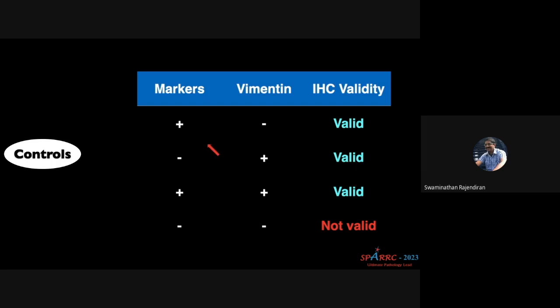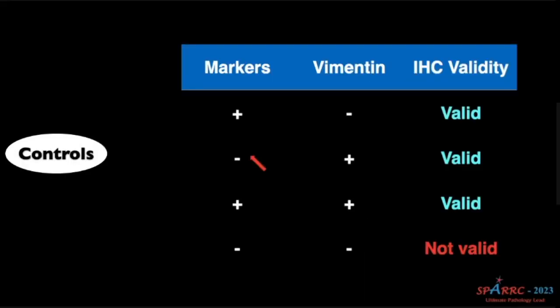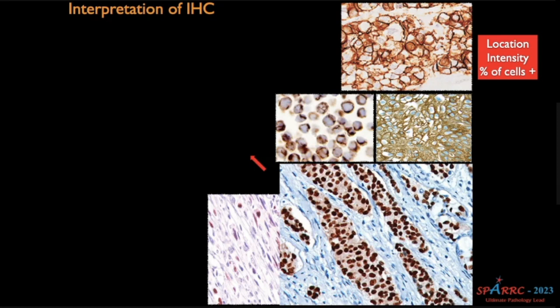Antigenicity control: if you are running 20 markers on a tumor and all markers are negative, you need to know whether the cell is displaying antigen at all. If vimentin is also negative, those cells may not be showing antigen, or the antigen was destroyed during processing. Run vimentin alongside your markers — if vimentin is also negative, that IHC run is not valid. If all markers are negative but vimentin is positive, that means we need to increase the number of tests to identify the antigen.